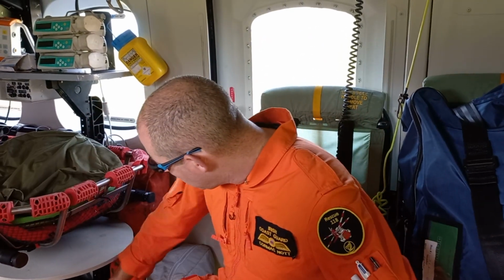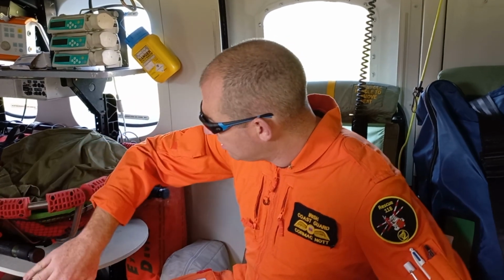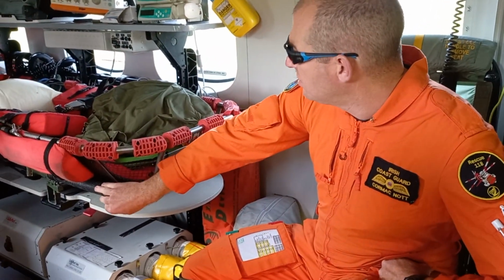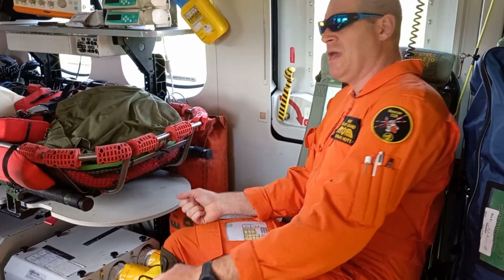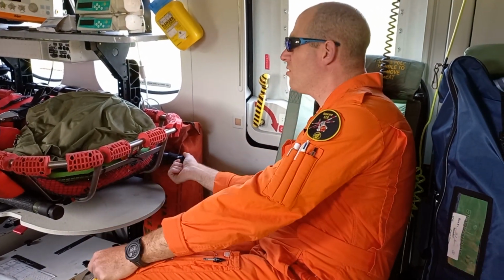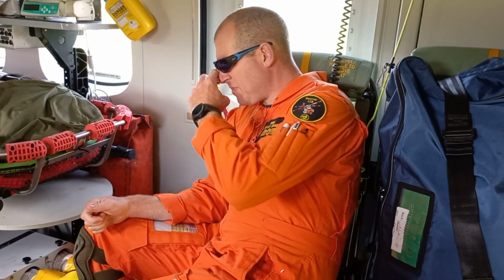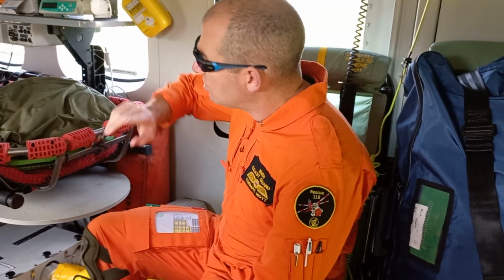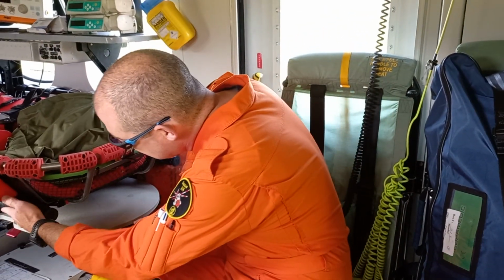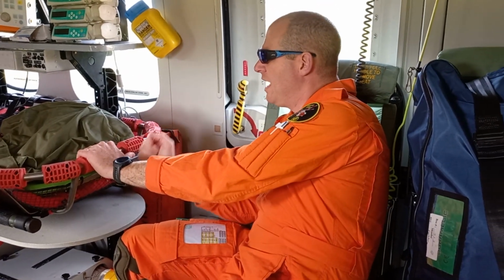Moving down the aircraft, we have our oxygen cylinders at the bottom here. Then we have 2 forms of stretchers. So as Jimmy was explaining, we have a hem stretcher. A hem stretcher is like the old carry-on stretchers. 2 or 4 people or more will carry this on. It has to go on the front and back, or up through the ramp. We'll move this big stretcher out of the way, and the patient is laid down on that, and that's how we can get it on and off the aircraft.